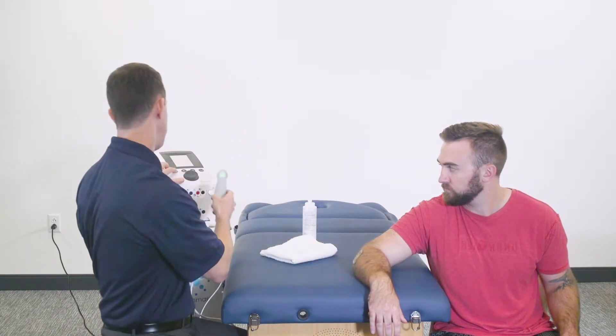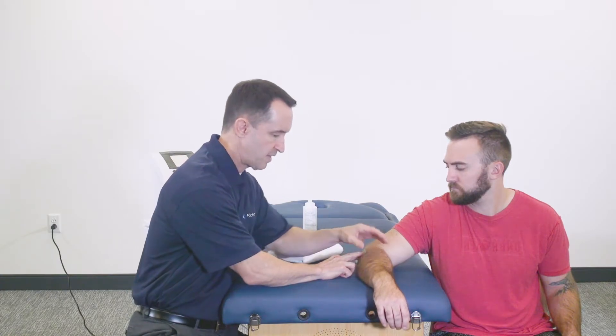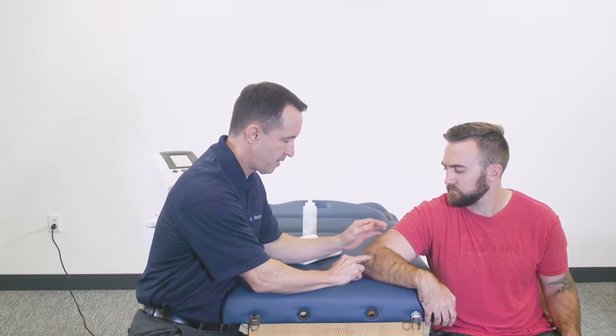At the end of the treatment, we stop it. Other considerations now that you have a nice hot, soft, elastic tendon — you have a three to five minute window. You can consider doing soft tissue mobilization, simply sliding your fingers over that tendon. If you have instrument-assisted soft tissue mobilization devices in your clinic, you can certainly use those now to really work on that tendon while it's soft and elastic.